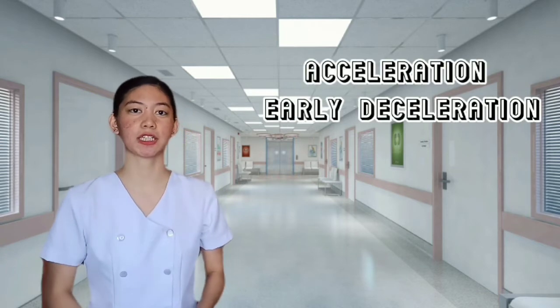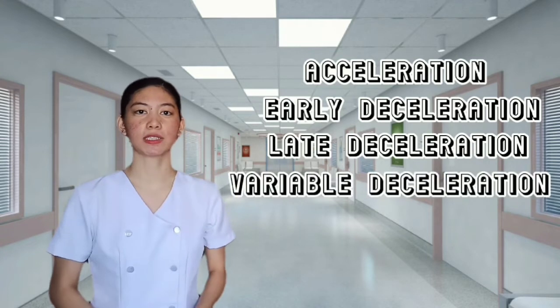Periodic fetal heart rate changes are the temporary recurring changes in the fetal heart rate baseline occurring in relation to the uterine contractions. There are 4 types: the acceleration, early deceleration, late deceleration, and the variable deceleration.